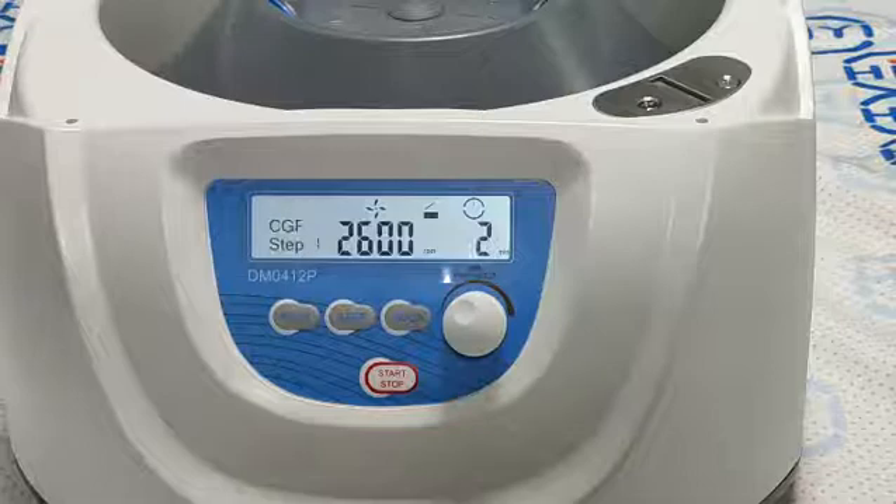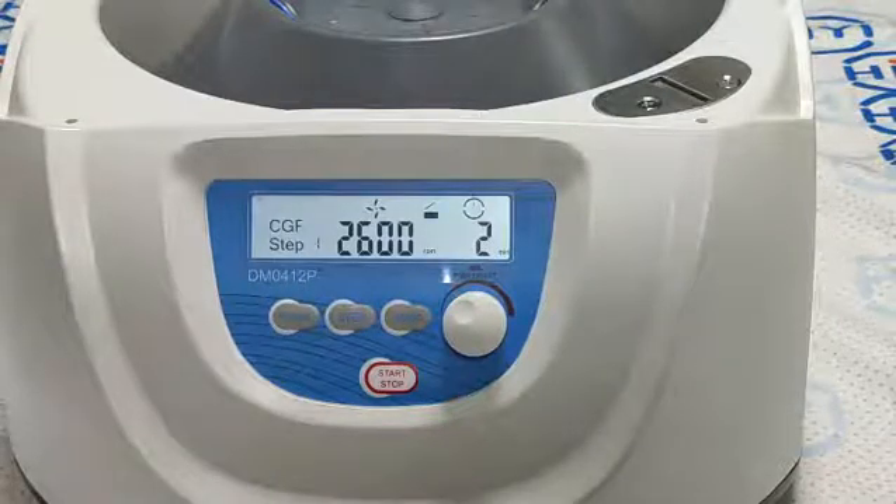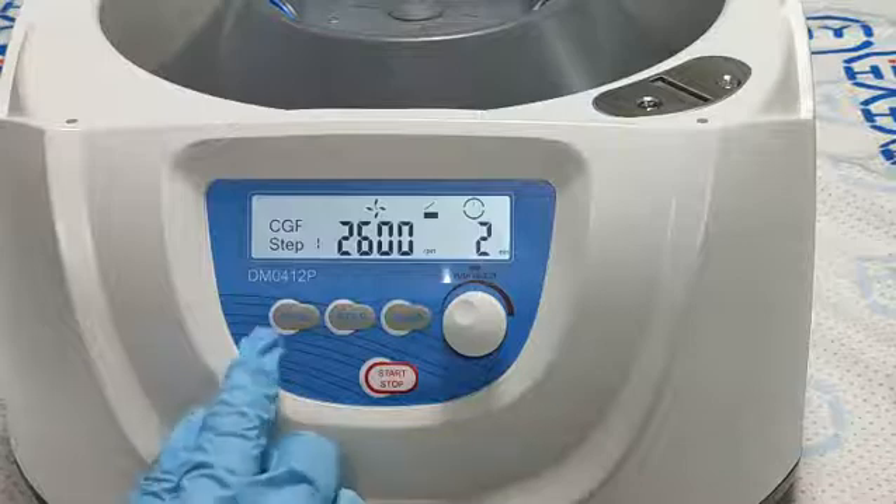Then we can select the CGFP program. The speed is 2600 rpm and time is 2 minutes.